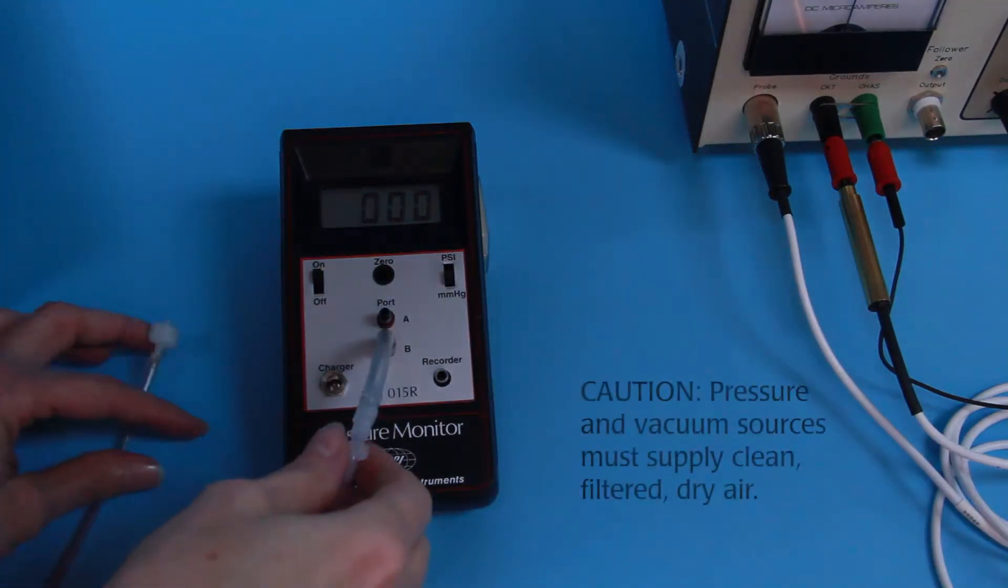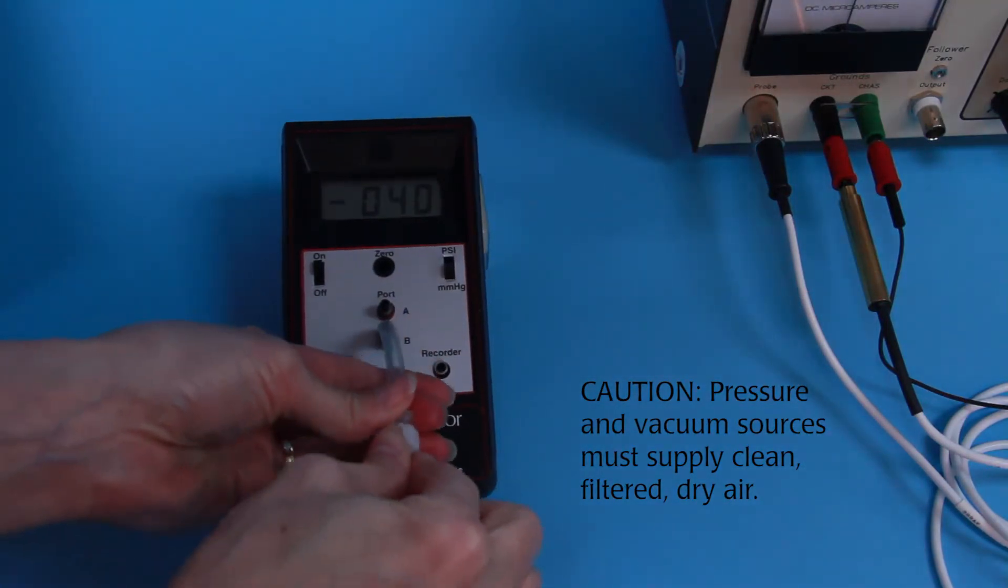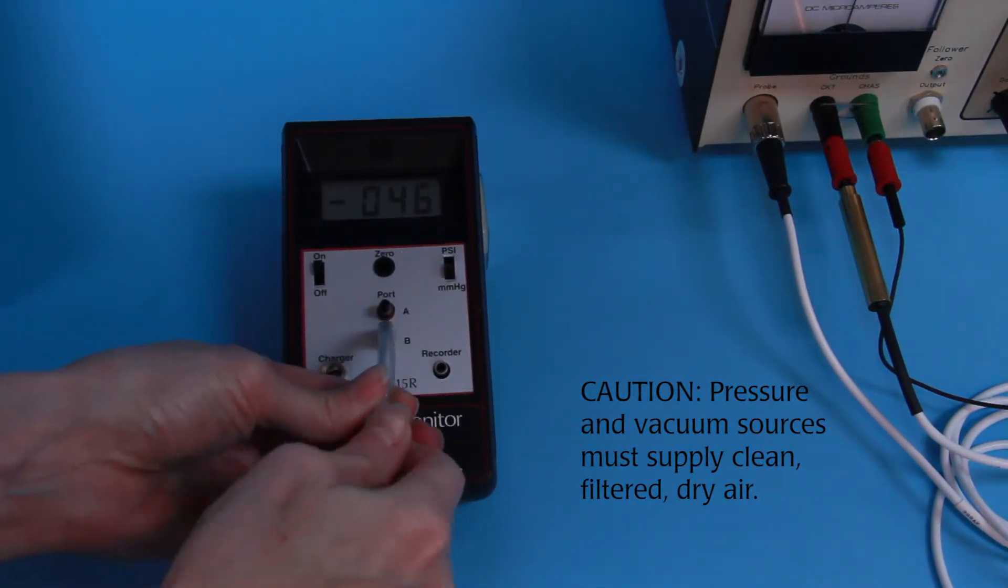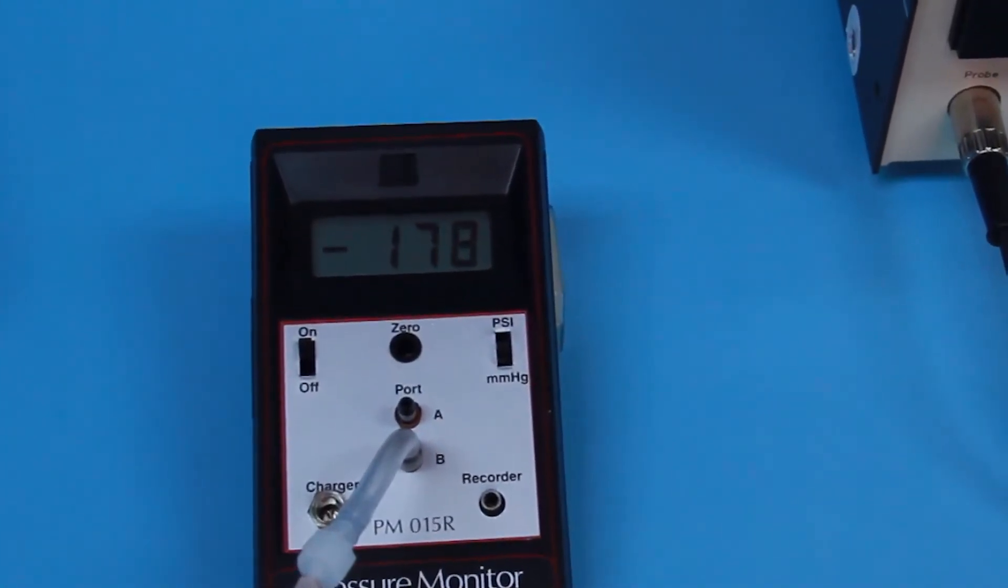It's important that the pressure and vacuum sources supply clean, filtered, dry air. Air that is not clean and dry damages the piezo valve, which is costly to replace. The pressure and vacuum may be regulated to pressures other than our suggestion.